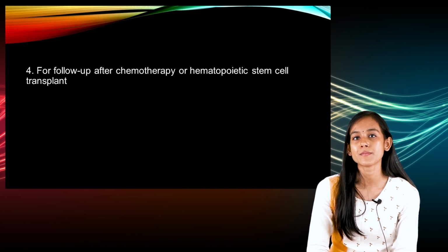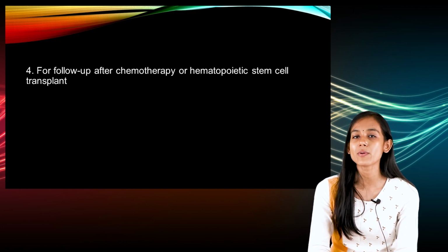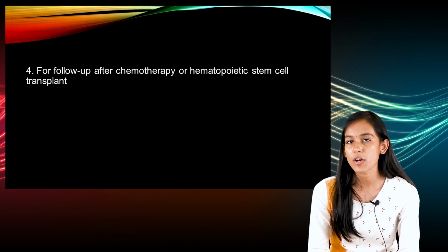So here, after the chemotherapy or after a stem cell transplant, bone marrow aspiration is usually done to see whether the treatment is working or not. So these are some of the indications. So let us move to the next part where we will learn about the contraindications of this procedure.